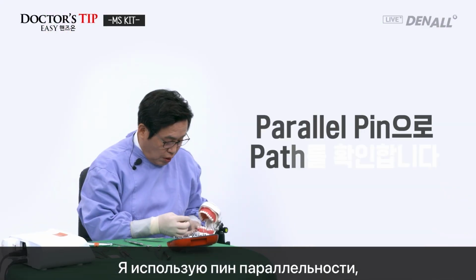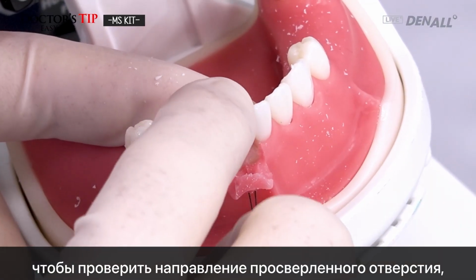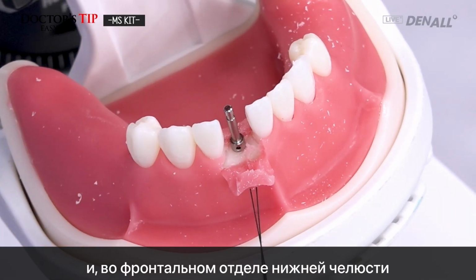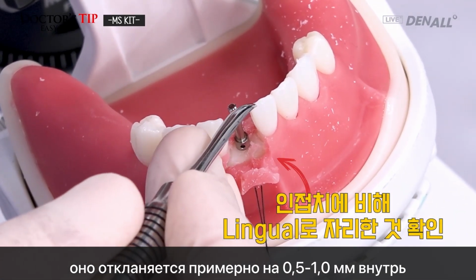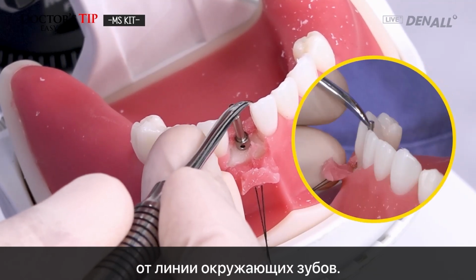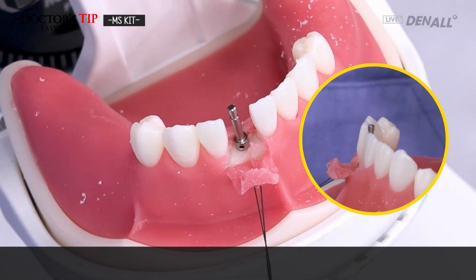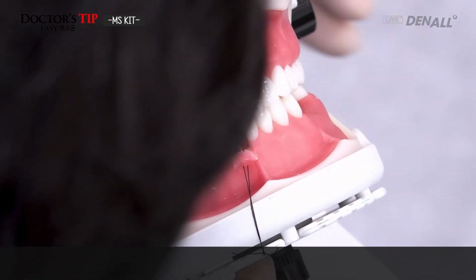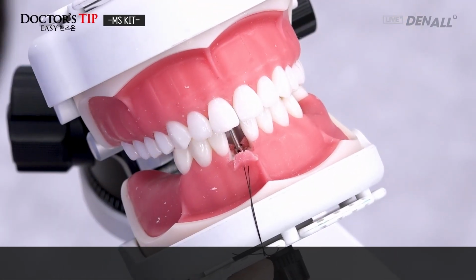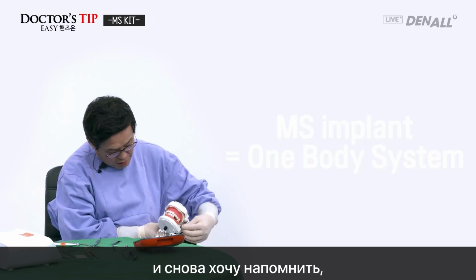I use a parallel pin to check the drilled position, and as you can see, on the mandible anterior side, compared to adjacent teeth, it's tilted about 0.5 to 1 millimeters toward the inside. And like this, you check the positioning, and on the upper side, on the lingual side, it's the correct position.